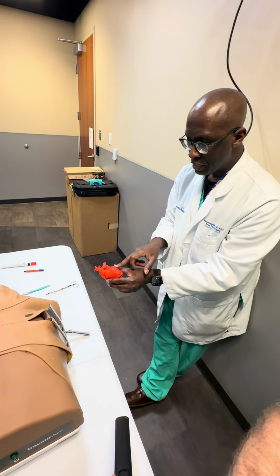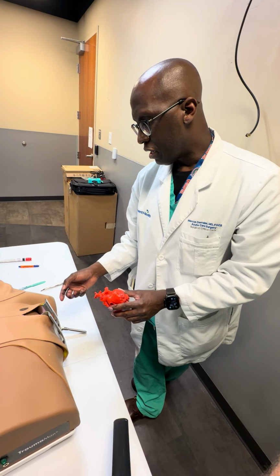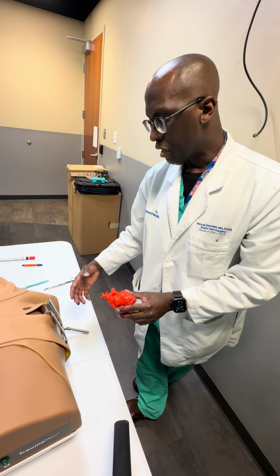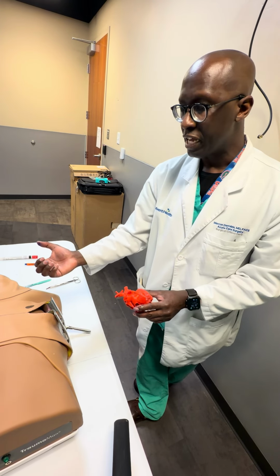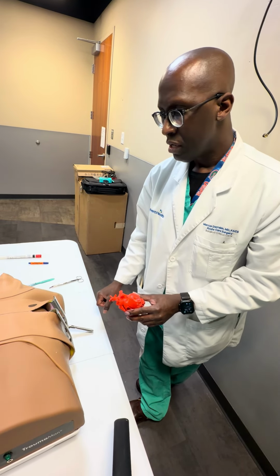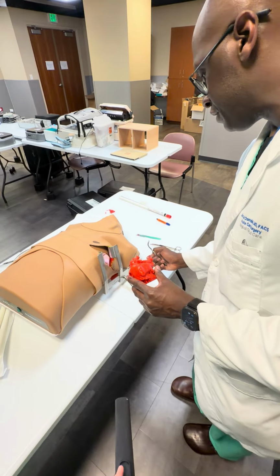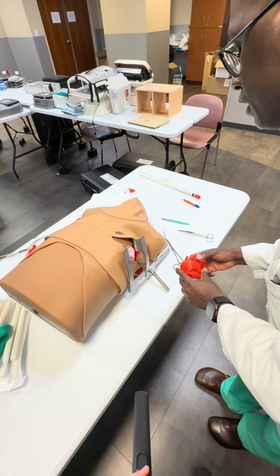If I don't see anything that looks like an obvious injury here, I'm going to inspect the hilum of the lung, as well as the peripheral lung tissue to see if there's anything that I can clamp. If there's an injury to the hilum, I'm going to clamp that with a vascular clamp or just even some Kellys.